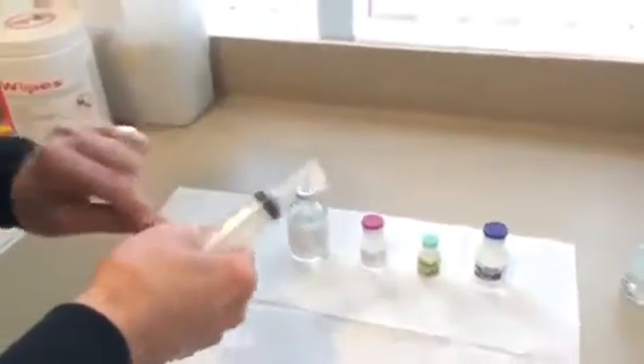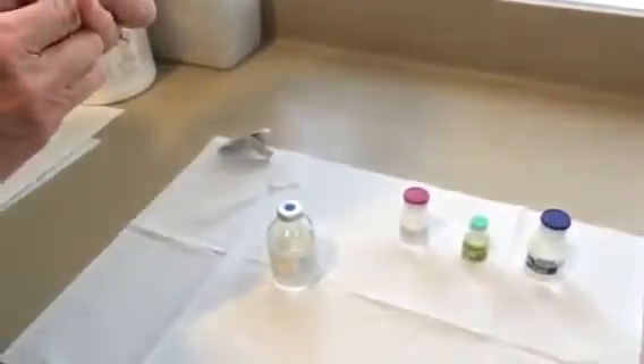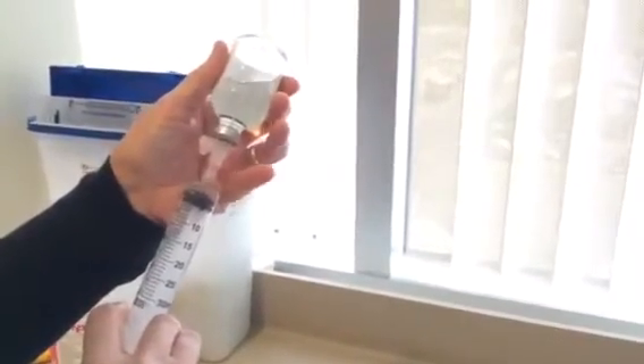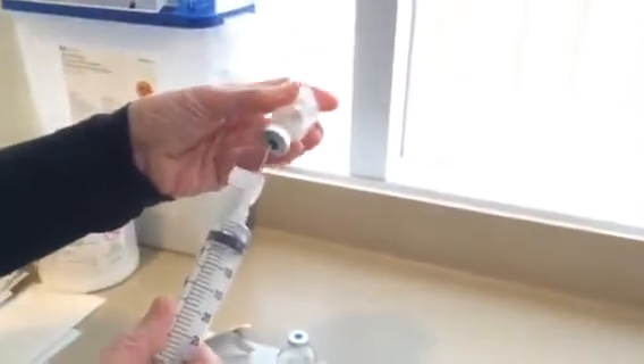In order to mix it up, we usually start with the sodium bicarbonate solution. This is 3 cc's of 8.4% sodium bicarbonate. We then put in approximately 5 cc's of sterile water.